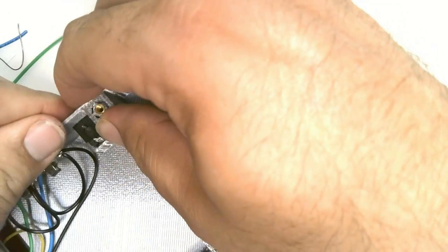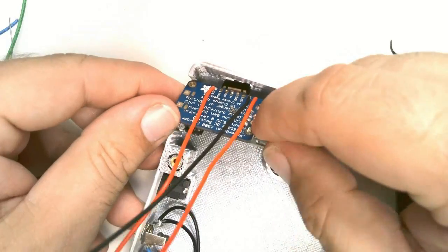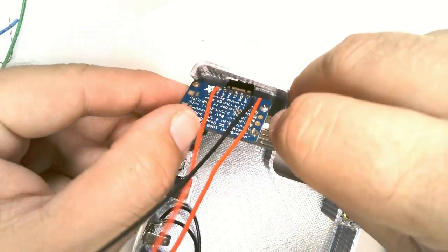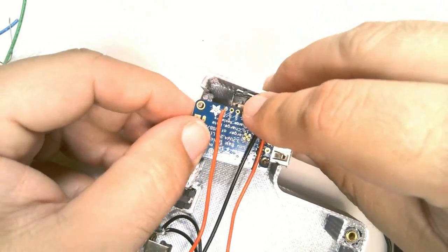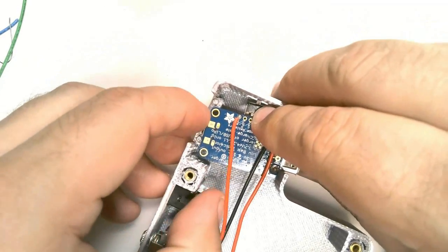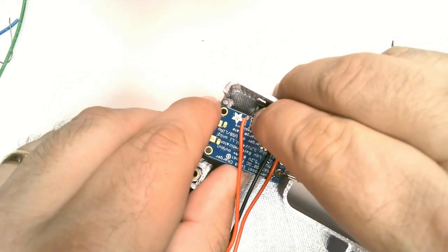Next, we insert the 2.1 millimeter barrel jack into the receptacle in the 3D printed case. Then we're going to insert the power boost board into its slot. Make sure that the slide switch protrudes through the slot in the side of the case.